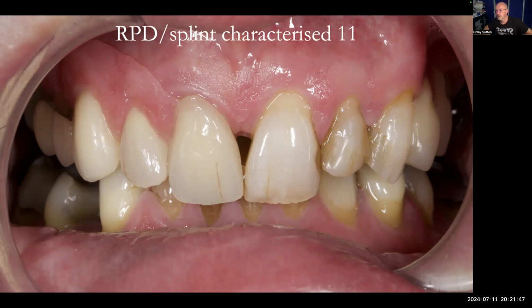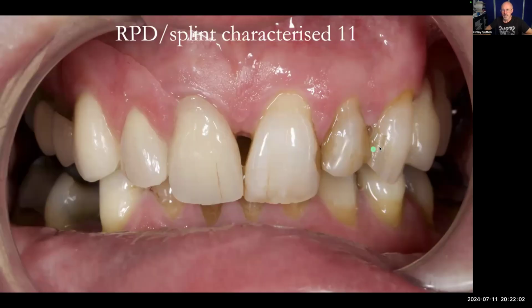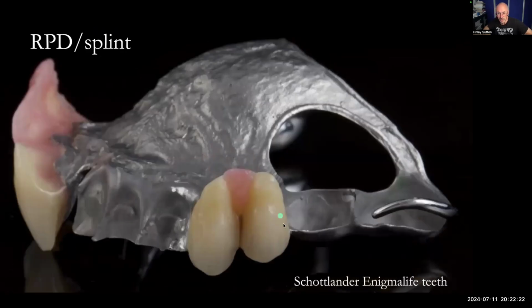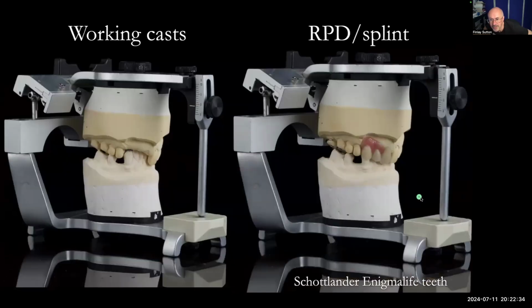So let's just look. The path of insertion is the key to this. Anterior retention is where it locks into these areas like that, just there, and also on the other side where we've got the single teeth. So it locks into that bit there. So that helps to retain it, Hein. But if we have a look on the other side, the other teeth do too. They help to keep it up just by slotting into the gap between those two there. That path of insertion in like that, so it just doesn't drop out. It's just really nice. And there's even metal in that place there too. It's really good.